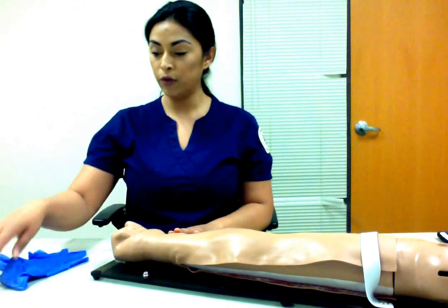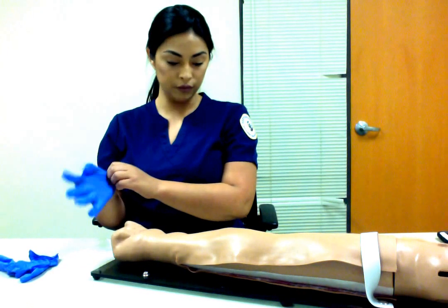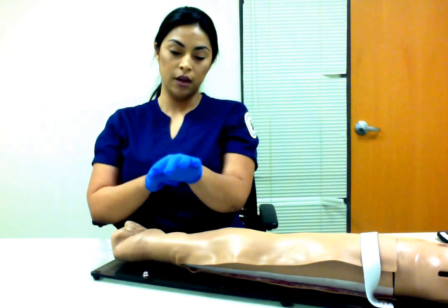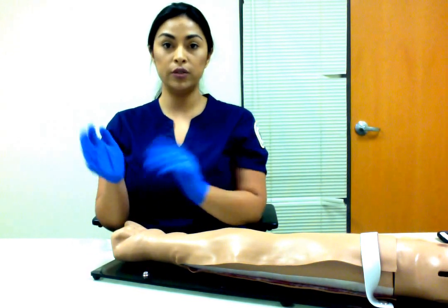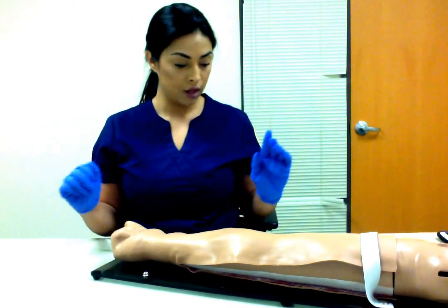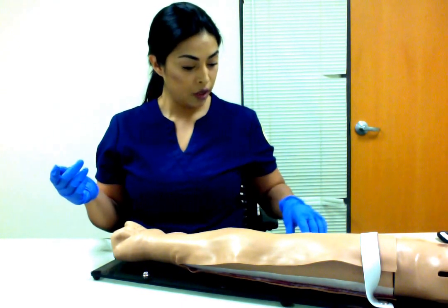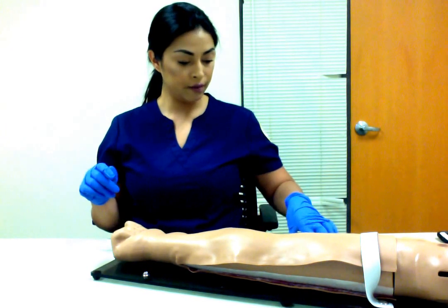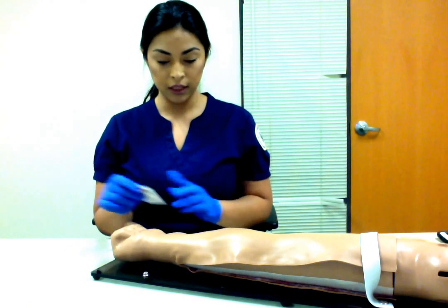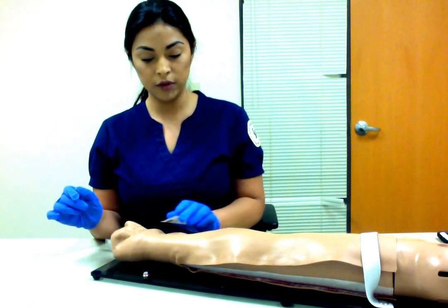At that point, before you start your blood gas sample, you would put your gloves on. A good tip would be to use a glove size smaller, because that will help you get a better feel for the artery. So at this point, you can go ahead and start cleaning your site. You would get the iodine packet, and you would clean the site, rotating around it until you are 2 inches away from the site.